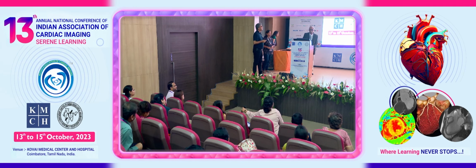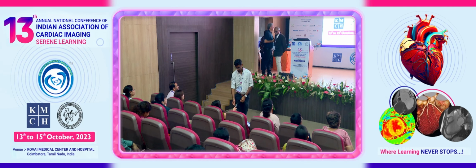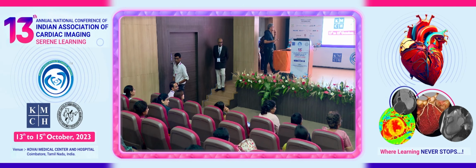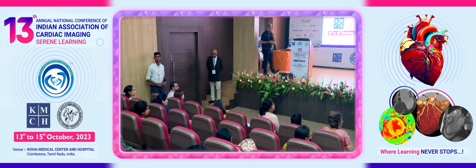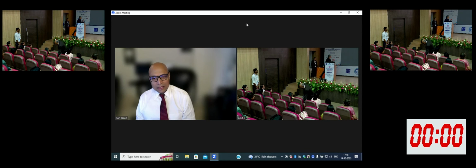Ron, any comment here? Ron, you're with us? But I think you really have to call it out, even if it's a dynamic compression. I think it should definitely be on paper, because even if it opens up in diastole, I would still call it out.